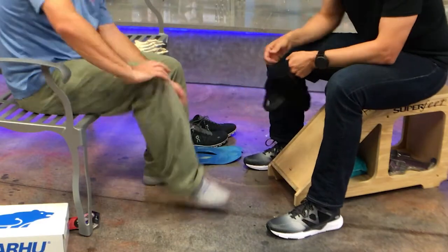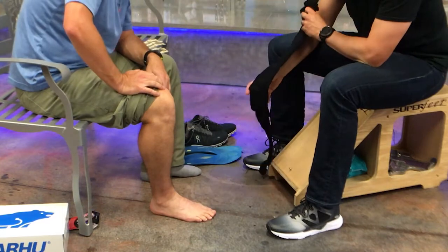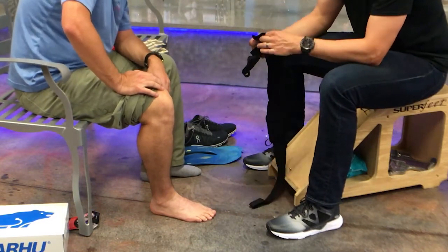Go ahead and take your sock off and roll your pant legs up. When you take the sock out of the package, it's best to leave all the Velcro straps attached. Just go ahead and flip it over the top like this.